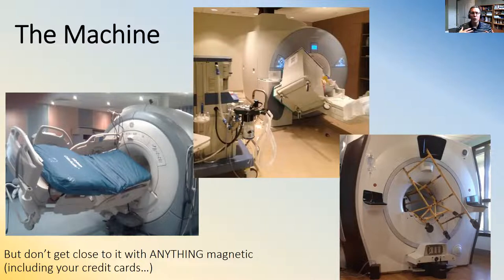No necklaces, no jewelry. They're very interested if you have implants. Has anything occasionally ever gotten into your body? They worry about, have you had an industrial accident in the past where maybe a piece of metal was lodged inside your skin? Because that actually can get torn out. Sometimes there have been some reports of people with tattoos who have highly ferromagnetic inks.